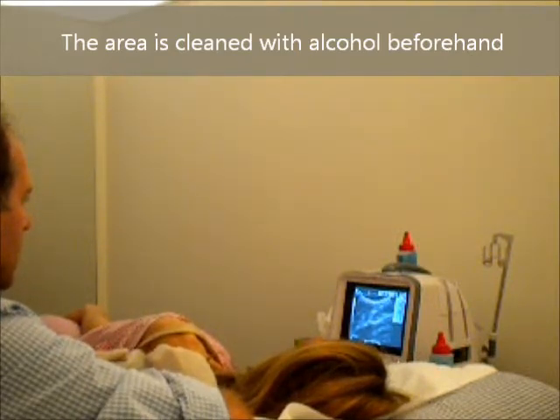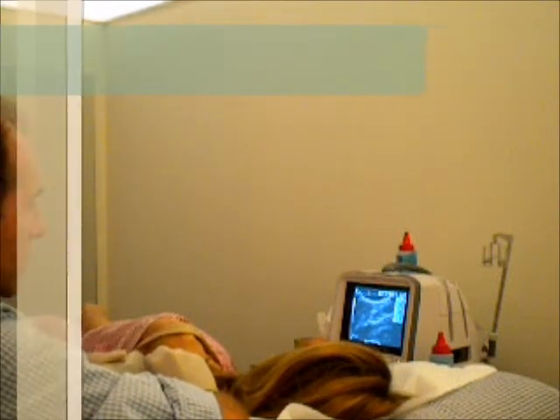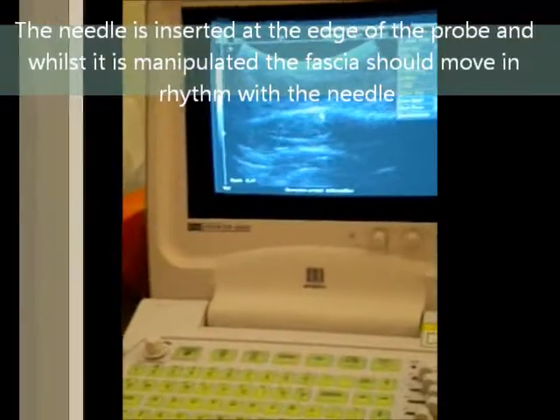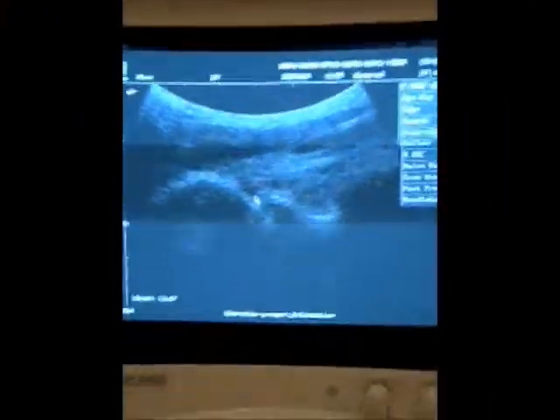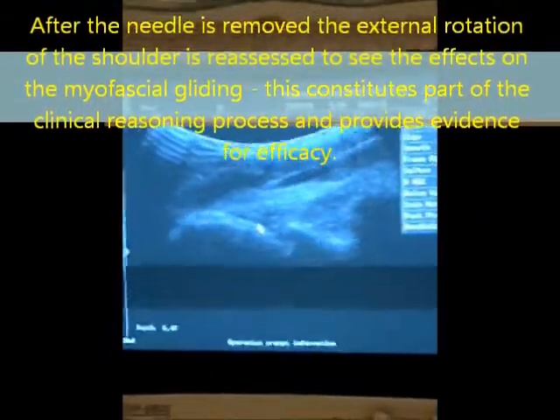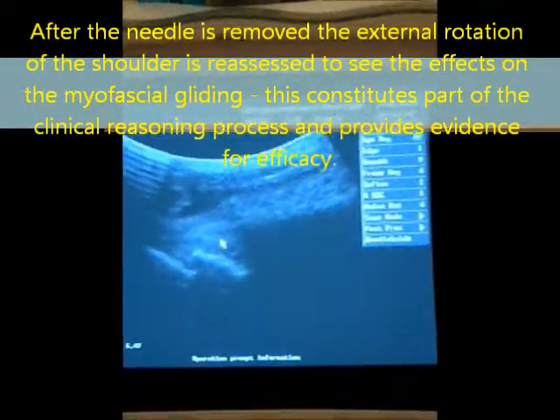There we can see on the screen the needle coming down towards the target. Now we can see that the whole muscle bulk is moving much more smoothly, much more easily. That's just after one needle.